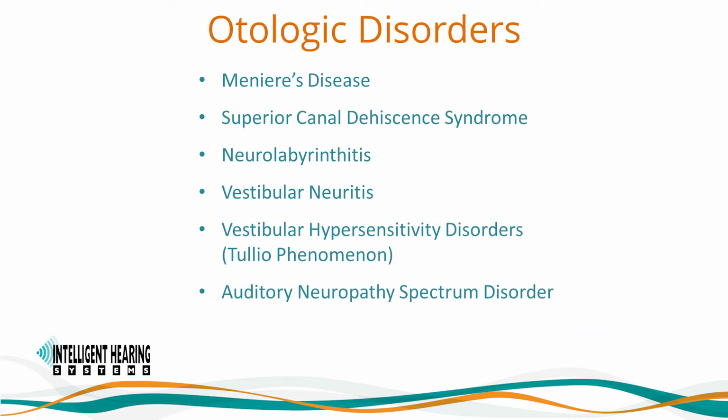Categorically speaking, otologic disorder applications include but are not limited to Meniere's disease, superior canal dehiscence syndrome, neurolabyrinthitis, vestibular neuritis, vestibular hypersensitivity disorders such as Tullio phenomenon, and auditory neuropathy spectrum disorder.